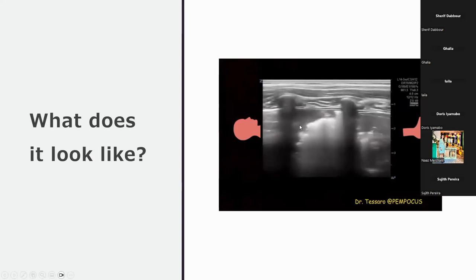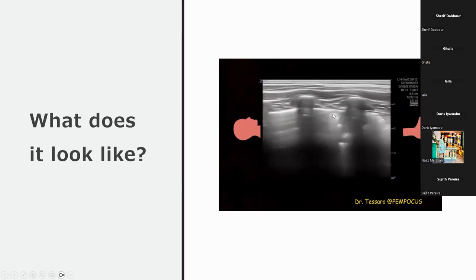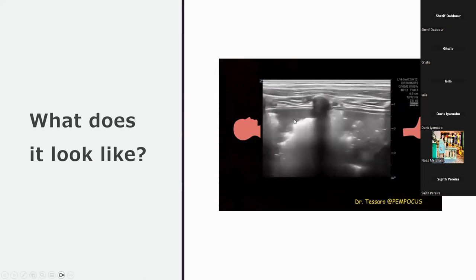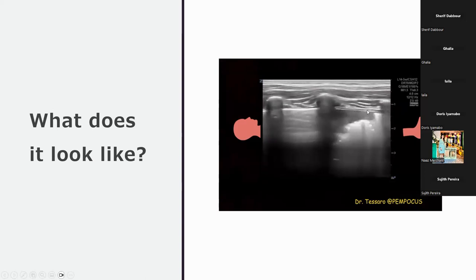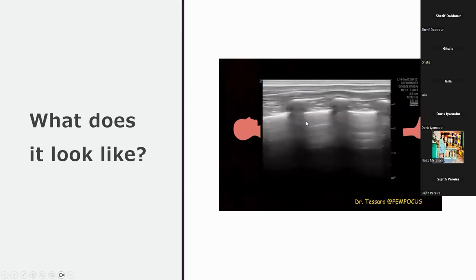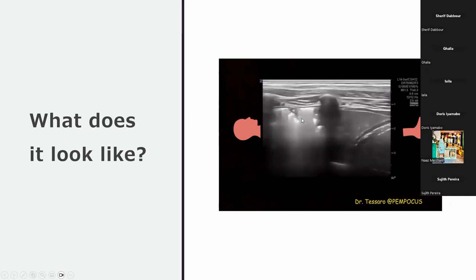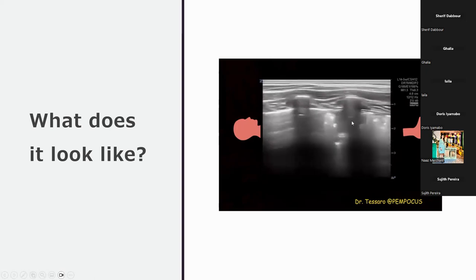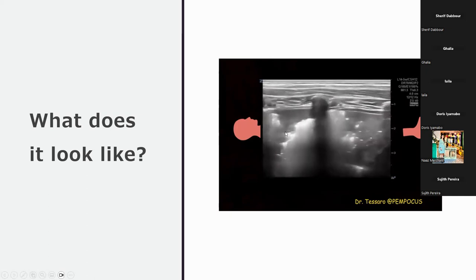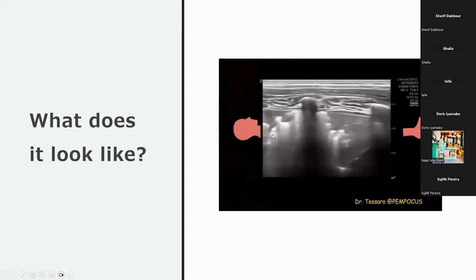This image here, can you see this? Yes. Why do I think this is not atelectasis and this is fractal sign? Can you see the pleural margin is established right to the top? Yes. Now, this is an irregular area below, right in the center here. A fractal sign occurs because tissue is destroyed as opposed to being atelectated or less aerated. So it occurs because the irregular margins of the destroyed consolidation have fallen back. And because of these irregular margins, the sound waves generated by ultrasound reflect in multiple different directions over each other. So this is a classical fractal sign for you.